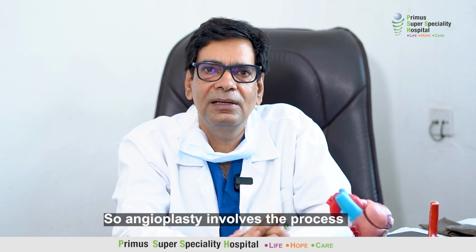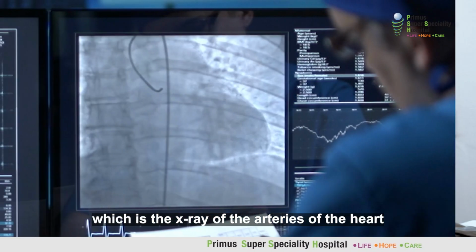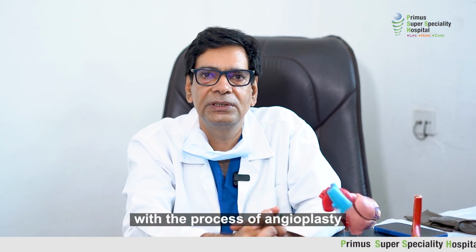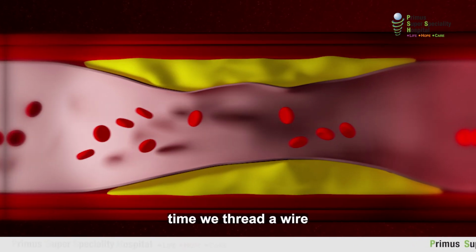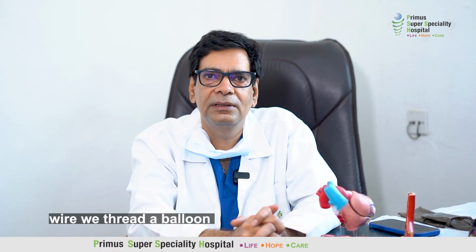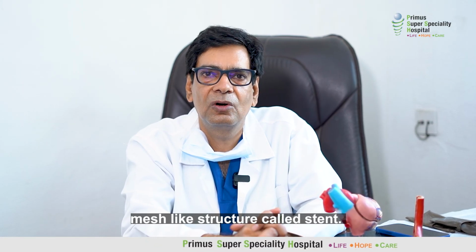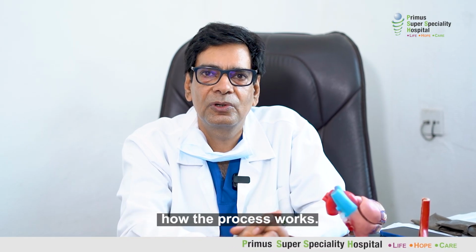Angioplasty involves a process in which first we do angiography, which is the X-ray of the arteries of the heart. In that we come to know where the blockages in the arteries are. And then if we decide to go ahead with angioplasty, in the same sitting or at a subsequent time, we thread a wire into the arteries of the heart. Over that wire, we thread a small balloon, and after we dilate the blockage, we put a small mesh-like structure called a stent. So this is, in a nutshell, how the process works.